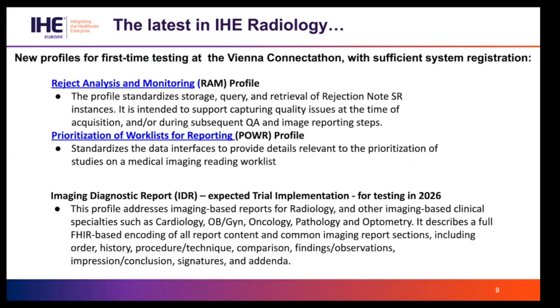The profiles we talked about are not available for testing at Connectathon, but the IHE Radiology Technical Committee is seeking comments and opinions from the participants of the Connectathon. The new profiles, which have been developed in the previous cycle, are now available and coming first time for Vienna Connectathon. Reject analysis and monitoring.